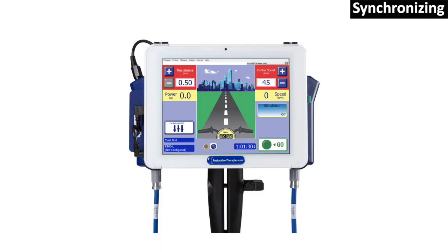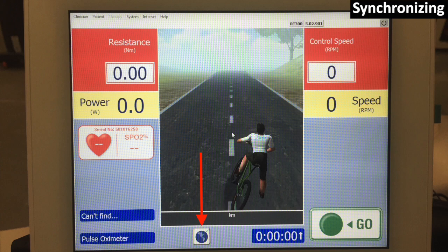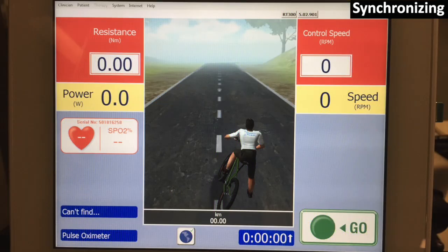All of the cycling sessions data is stored in the tablet locally until it is uploaded onto the RTI-Link server. Ideally, we ask that sites reconnect to the internet every 2 weeks to synchronize cycling sessions data with rtilink.com as well as update the Sage software. Ensure that the globe is blue with a green check to synchronize.